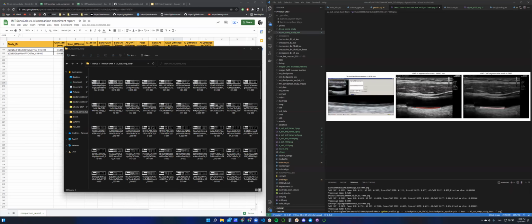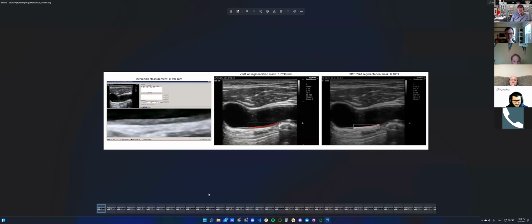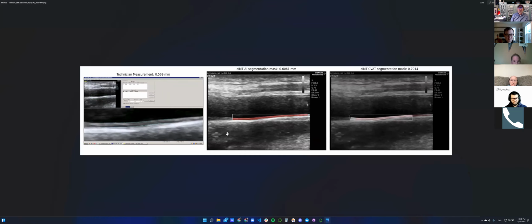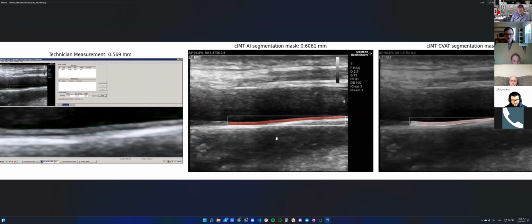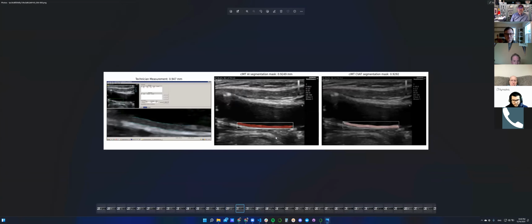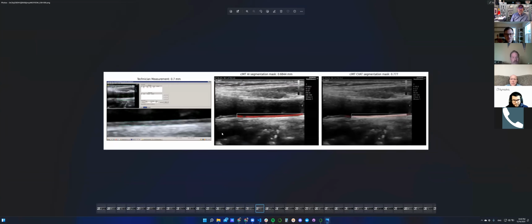Okay. Wow. And we have a whole bunch of results that, if it's interesting, either now or later, we can flip through on a case-by-case basis. But in general, oh yeah, John has it up here. You can just see quickly as you go through that it's hard to find one where there's a big disagreement. He was pulling up some of the examples. Yeah, you're not kidding. You got this.